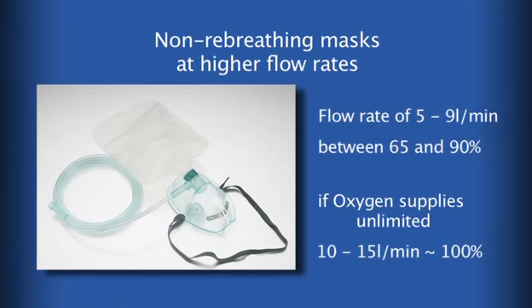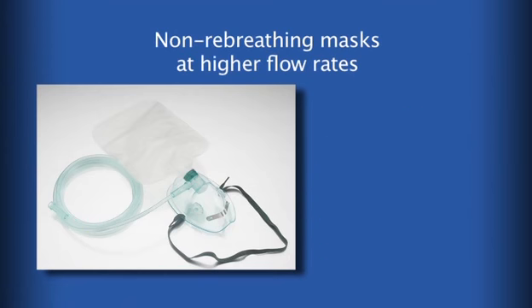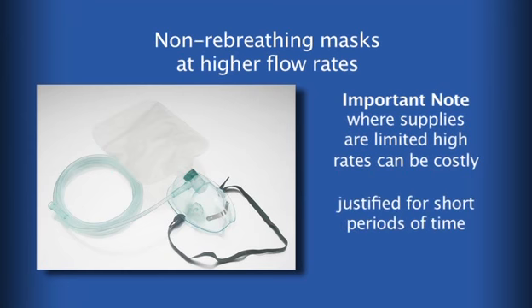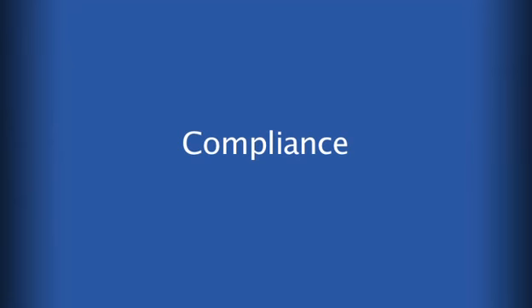But note, in situations where oxygen supplies are limited, these very high flow rates of oxygen will be costly for such a marginal increase in inspired oxygen concentration. However, this may still be justified for short periods during severe, life-threatening emergencies.